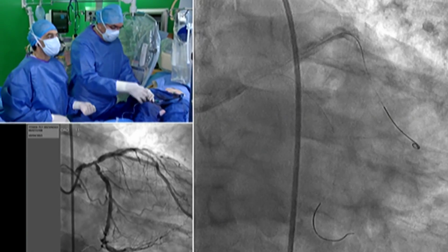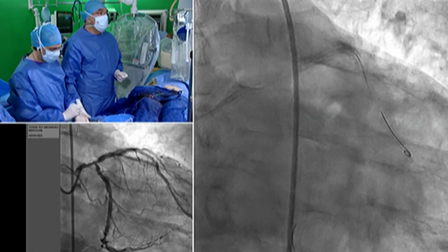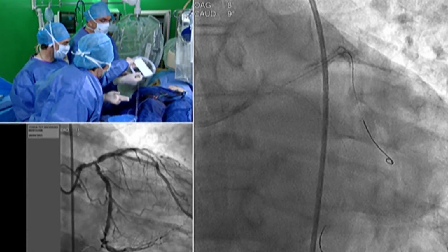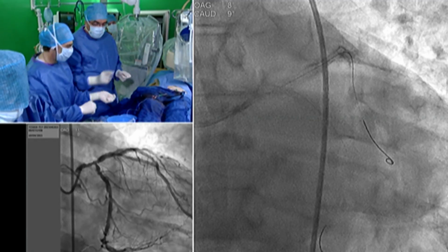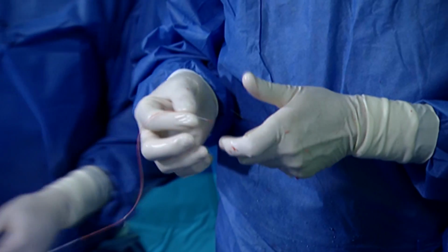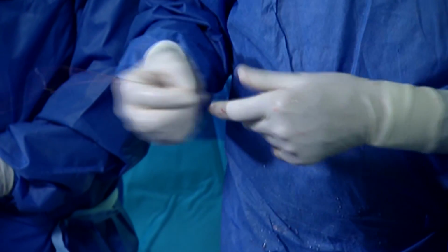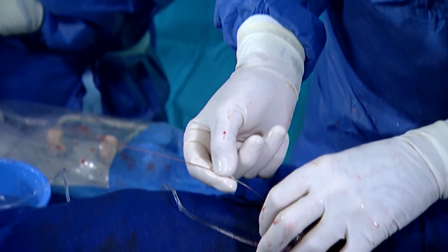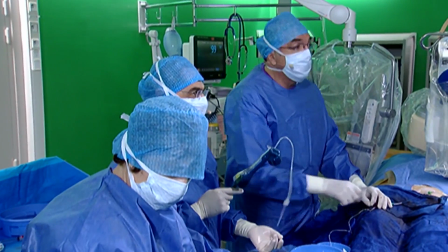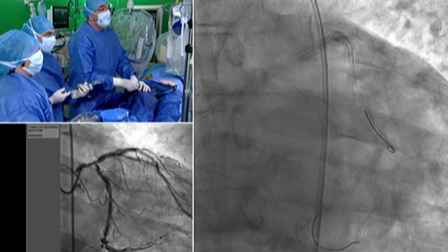It's a DES, a Xience stent. Really, it doesn't matter. It could be done with any type of new generation DES. The problem is more in the quality of the plaque preparation with very high pressure non-compliant balloon, or the use of a special device, as you say, with rotablator. And then a post-dilatation, which will be very aggressive after the stent placement. And then after that, we will control, if we have time, I hope that we will have the time to show you the OCT control using this fantastic tool, which is the co-registration, OCT angio.